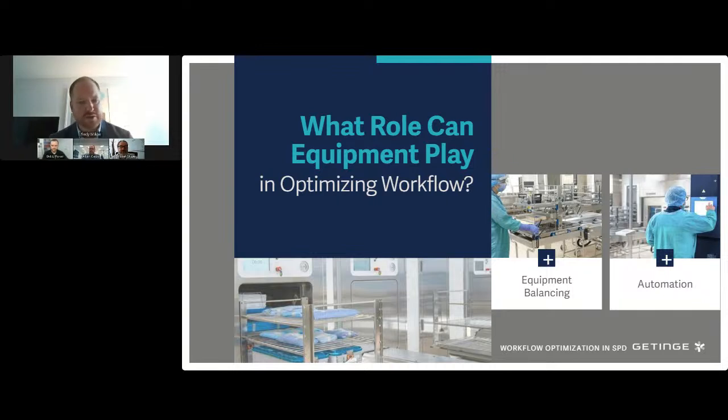So making sure you've right-sized your equipment, making sure you understand what your throughput and capacity is critical in starting that process.